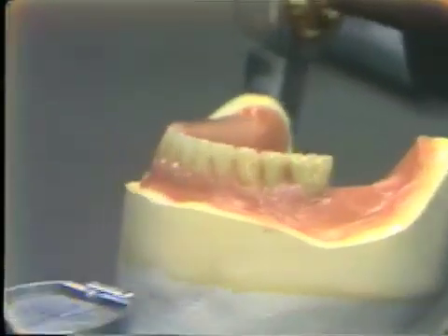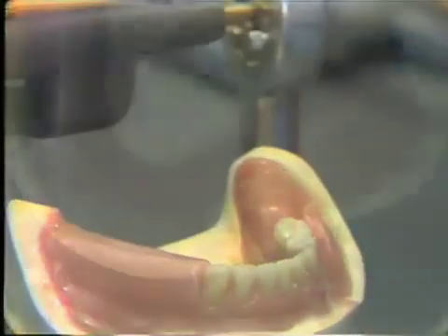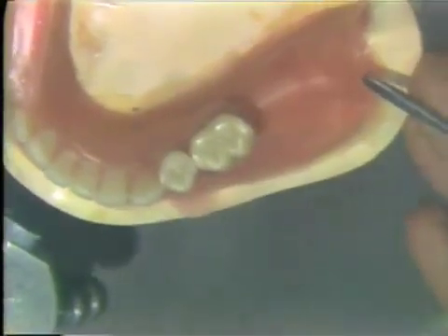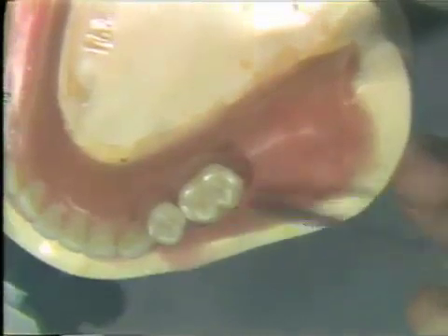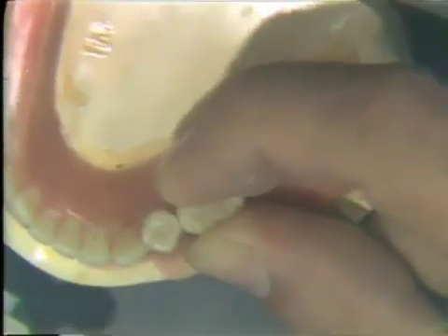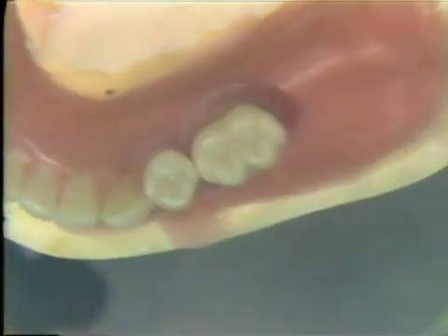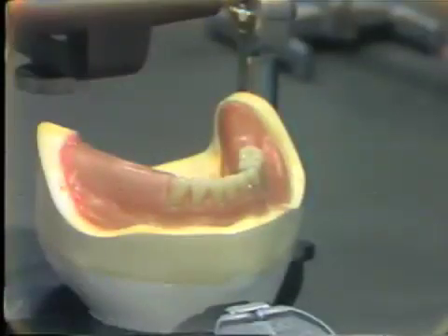Looking from the occlusal view you will notice that the tooth proceeds down from the cuspid towards the retromolar pad evenly, with ridge structure to the buccal and to the lingual. It looks as though we are moving a little bit too much towards the lingual, so I'm going to rotate the tooth out slightly. Now we can go ahead and seal that tooth in position in preparation for setting the second molar.